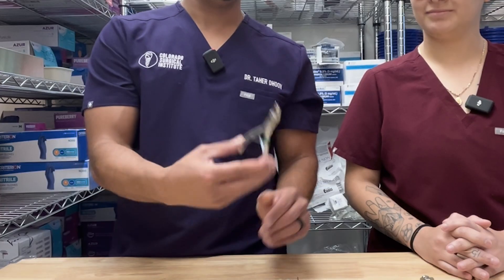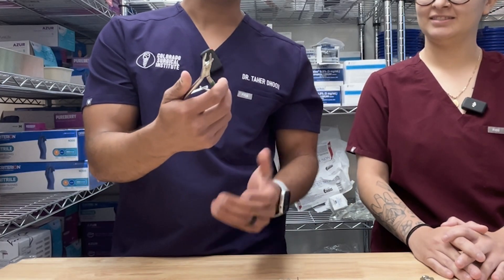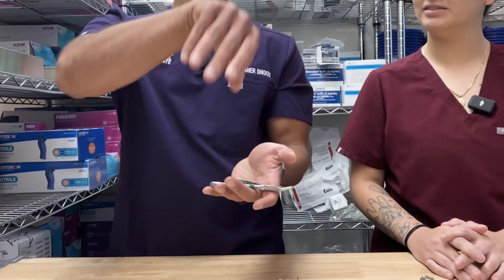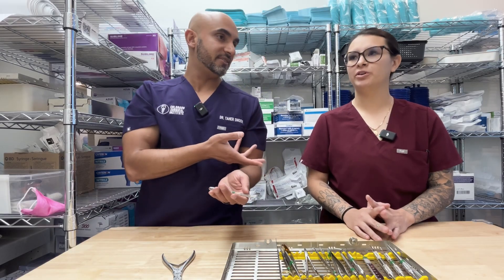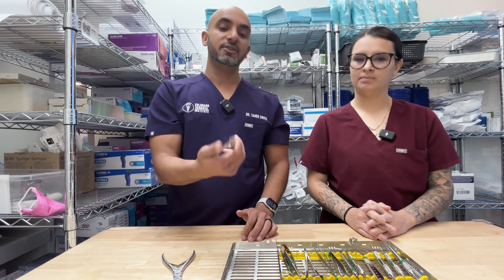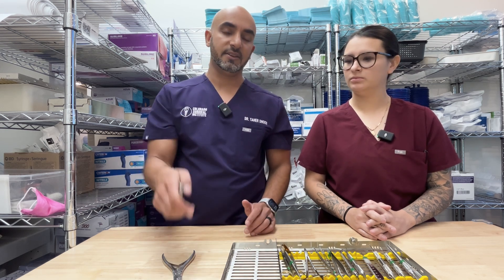And then you got your little baby rongeurs. These are good for little root tips, but also really good if you have excess papilla, granulomatous tissue, or infection tissue — you just take this and rip all that out of there. Good to get small bits out, tissue tags on the bone — you can go ahead and get that out of there.